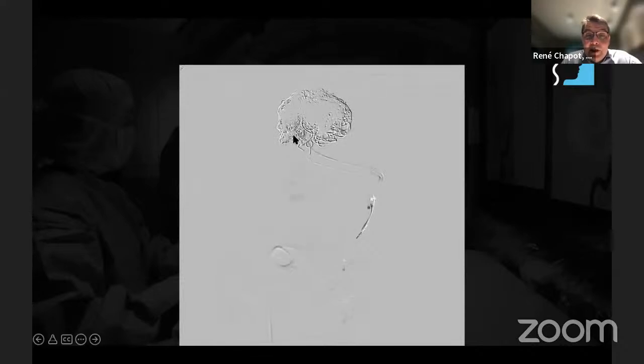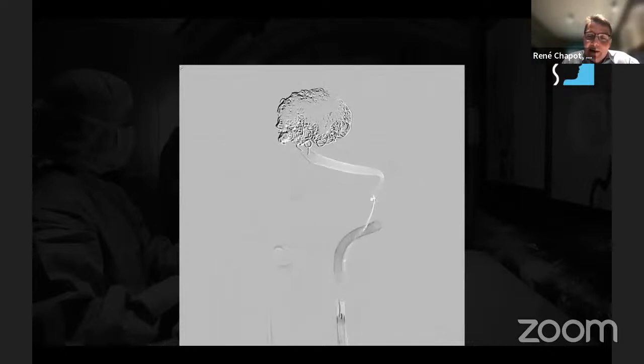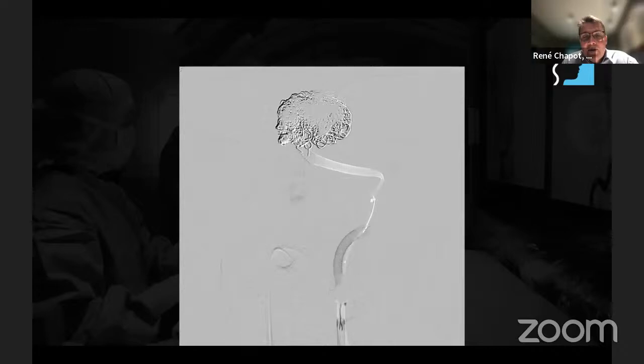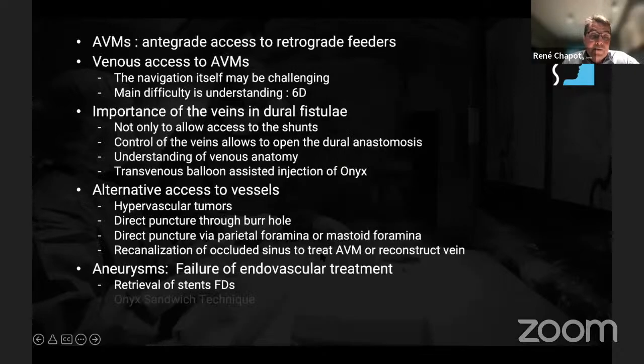So the only way to go here is to take the flow diverter, the pipeline, out. So we developed a technique, which we published last year, to combine a stent retriever and snare: the stent retriever to anchor, and the snare to take the flow diverters out. And interestingly, as soon as the flow diverters were out, the artery immediately reappeared and the bradycardia was gone. So definitely some central origin was the cause of this bradycardia.